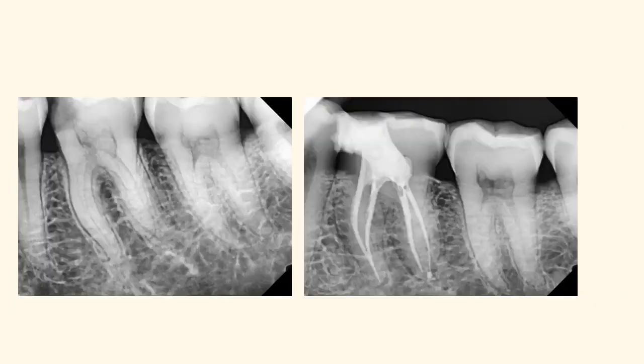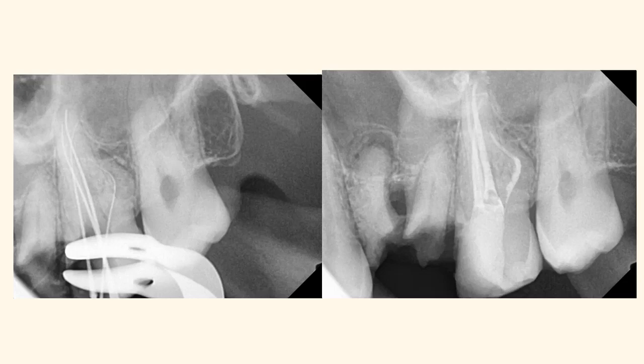This is a case of confluent canals in the mesial root. The same protocol is followed, resulting in proper glide path preparation and predictable endodontics. Another case of acute curvature in the distobuccal root.